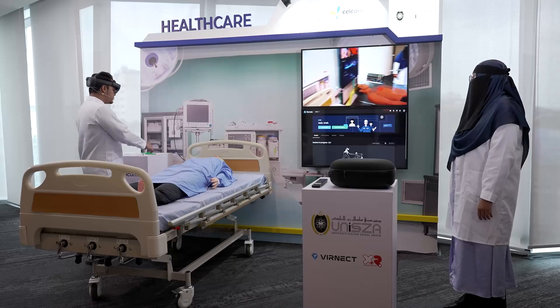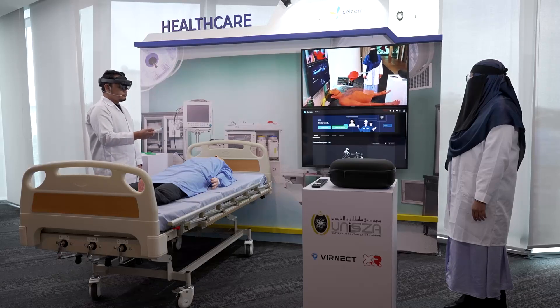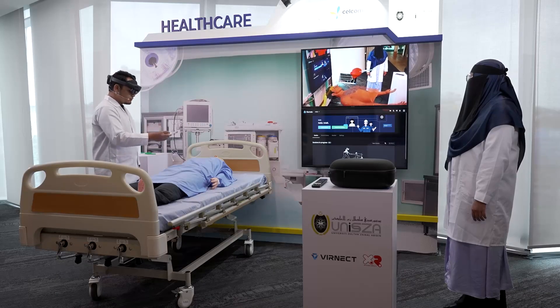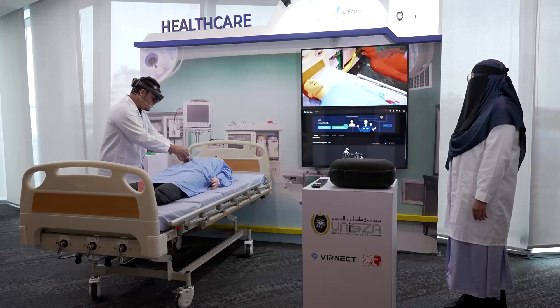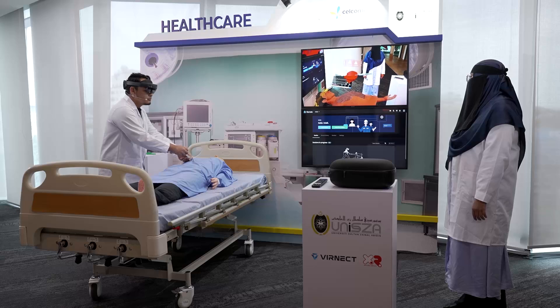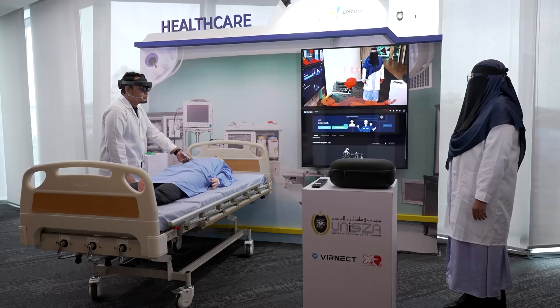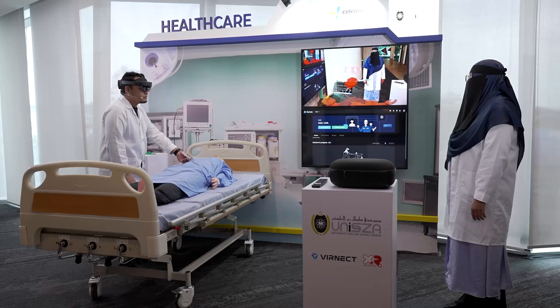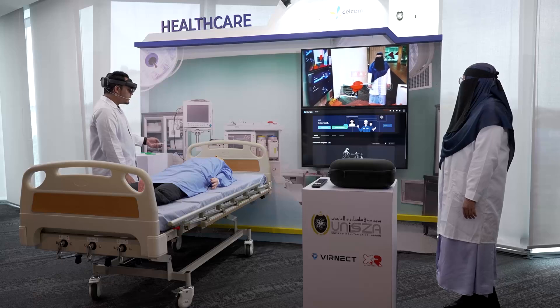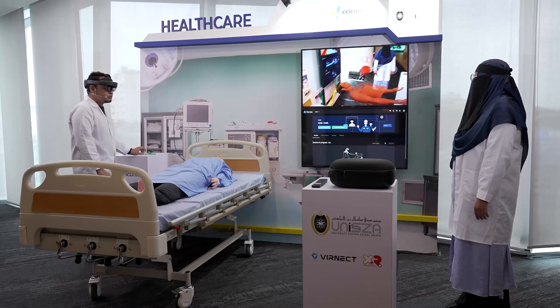I take the syringe and lift in the green area. The AI detects cardiac arrest in my patient, so I need to perform CPR.